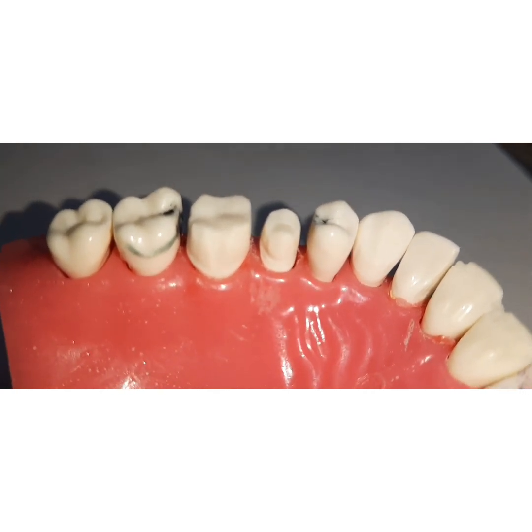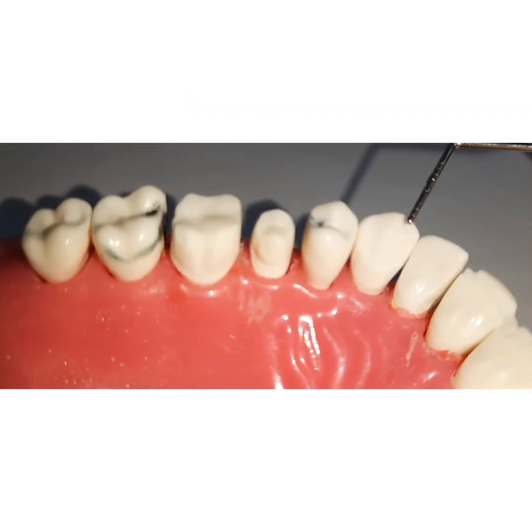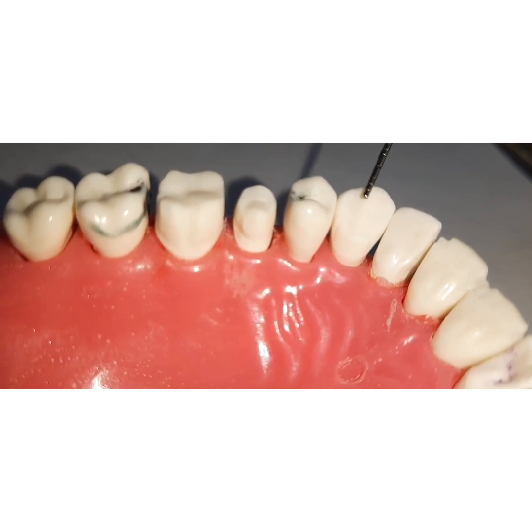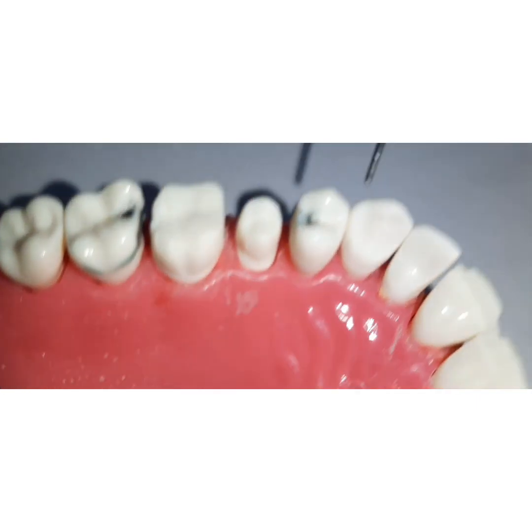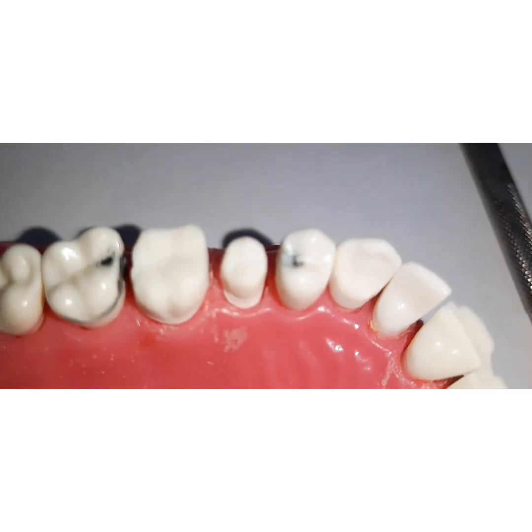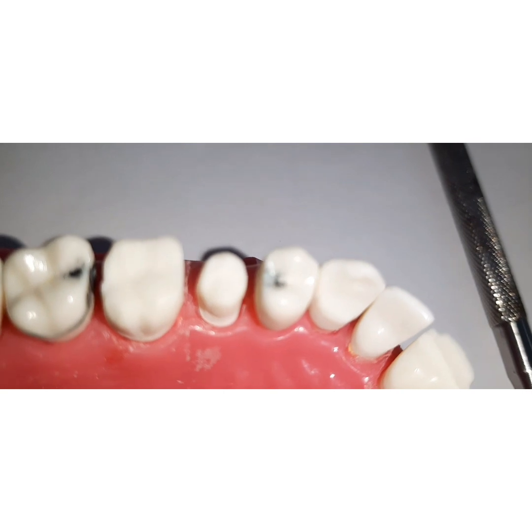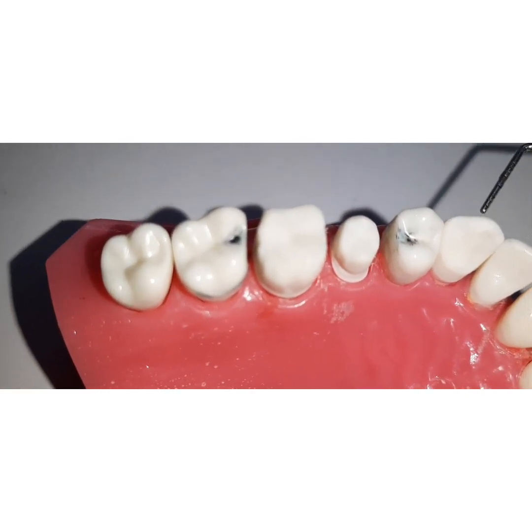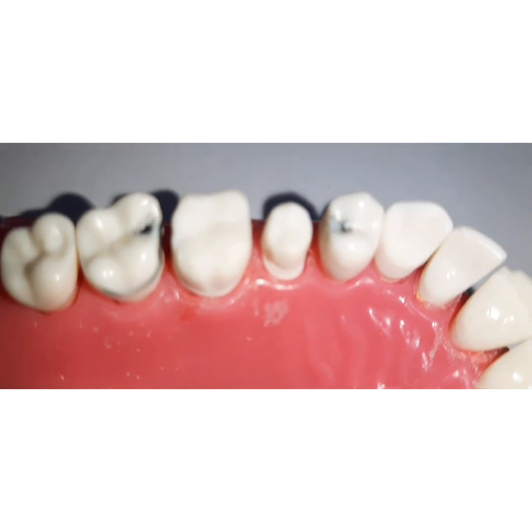Next we do the incisal reduction. Using a wheel diamond bur, go along the incisal edge of the tooth surface following the contours of the incisal edge, including the mesial and distal inclines, reducing approximately 0.7 mm. Make sure you do not touch the labio-incisal wall so that metal does not display on the labial side, which would give an unaesthetic look.